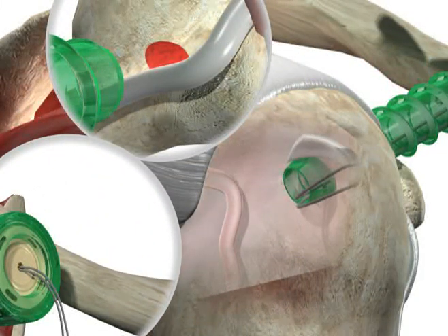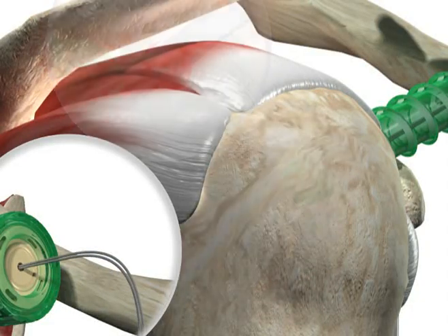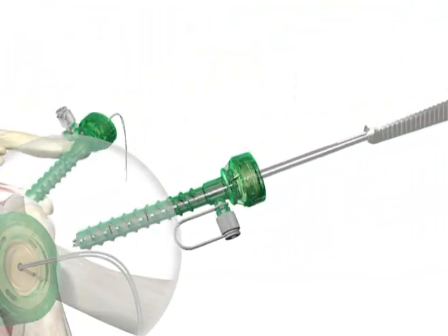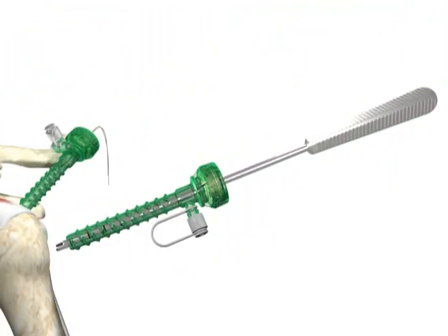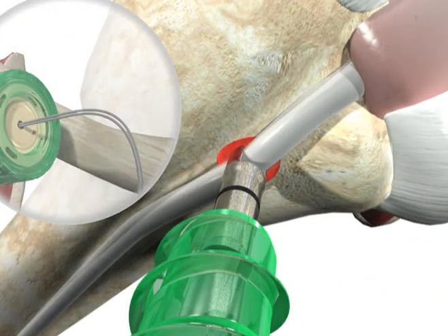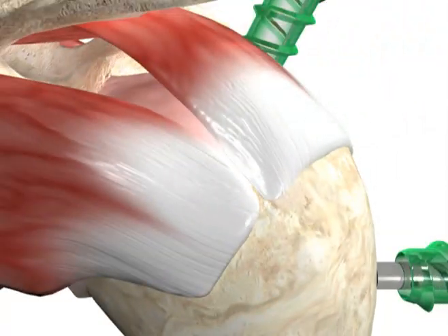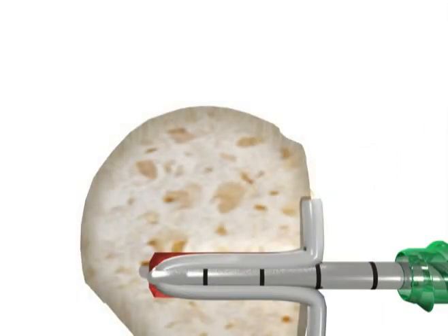Using the proximal sutures, tension the biceps tendon to return the long head of the biceps to the desired tension. At this point, it is important to release tension on the biceps tendon. Place the tendon fork through the cannula and capture the tendon. Insert into the drilled hole until the tendon reaches the far cortex. When pushing the biceps tendon into the prepared hole, release tension on the biceps tendon to allow it to easily slide into the hole.